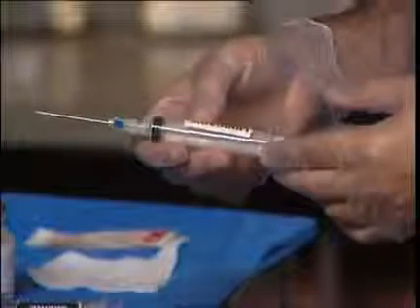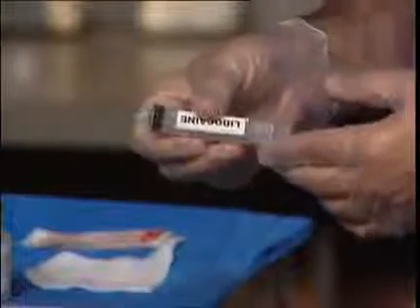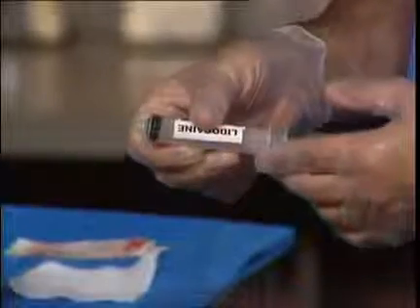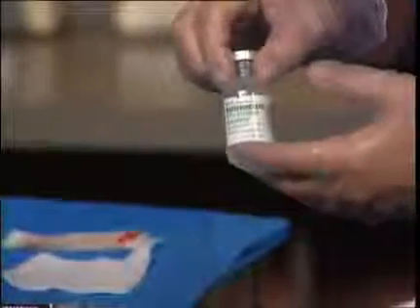In order to facilitate a proper block, the following equipment is required: a chlorhexidine prep for sterile technique, a local anesthetic syringe with a 27 gauge 1.5 inch needle for local anesthetic placement, preferably 1% bicarbonated, buffered lidocaine, a syringe containing the epidural steroid mix, which is composed of 1% lidocaine 1 cc, 6 cc's of bacteriostatic saline, and then 40 to 80 milligrams of triamcinolone Kenalog, which is a particulate steroid.